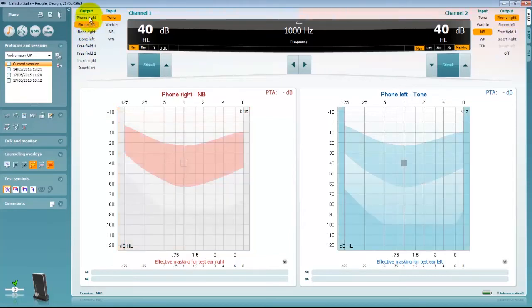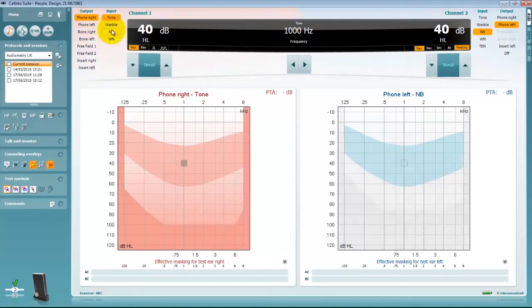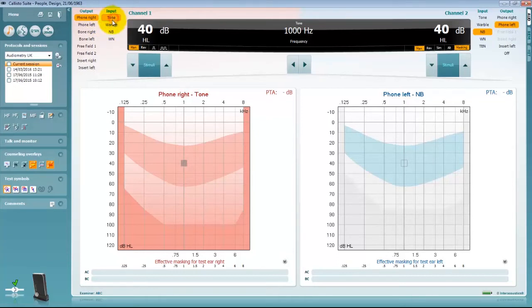On each channel side you can choose which transducer is being used and also the stimulus. The system can be operated via mouse control or via PC keyboard shortcuts.